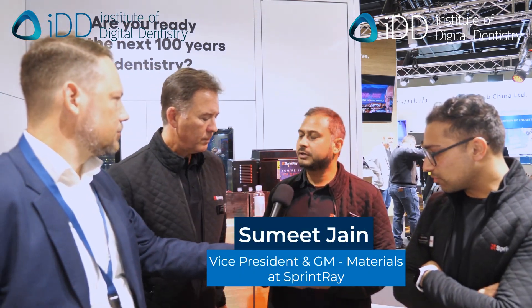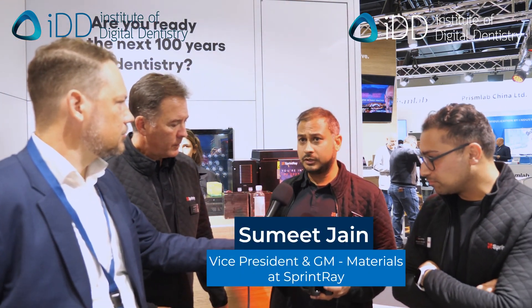Post-processing for this particular crown material is very easy. You can just spray with alcohol and wipe — spray and wipe. The whole workflow from scan to print is under 45 minutes. We account for nearly five minutes of post-processing in there, but it can be done in seconds with practice. Printing is less than 10 minutes, so scan to deliver is 45 minutes.